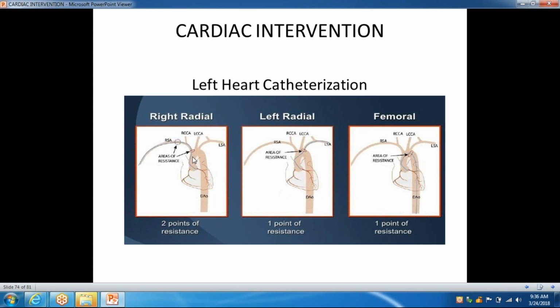So all you do is position the catheter into the vessel. What I normally use if I'm going to cannulate the left main, I'll use a left Judkins catheter, usually a 3.5, because I'm now doing radial. For the radials, I'll use a little smaller curve.